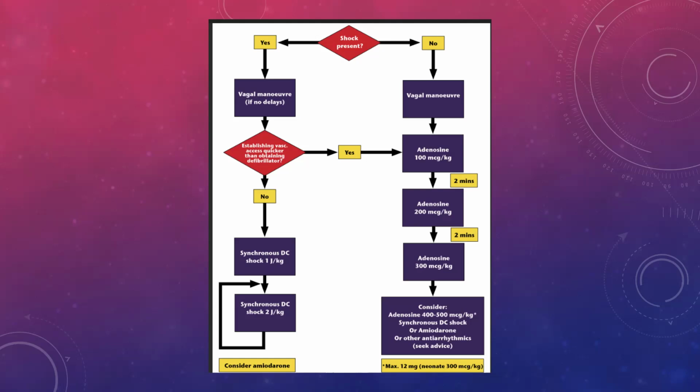But basically, with synchronized cardioversion, well, defibrillation, to put it bluntly, is when your heart is fibrillating. It's just moving all over the place. There's no rhyme or reason to how it's contracting. So what we are doing is the equivalent of switching it off and on, like what you do with your phone.